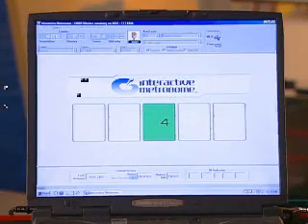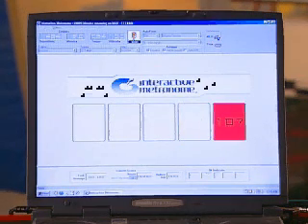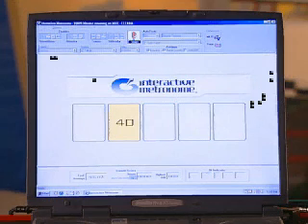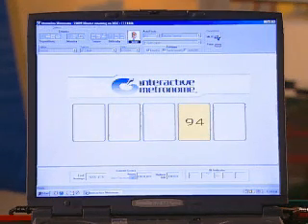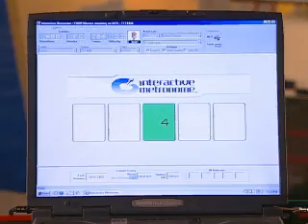If a patient initially has difficulty working with the audio feedback, the IM system also incorporates visual feedback that the therapist can temporarily activate. The visual component reinforces the audio feedback when the patient hits early or very early before the IM beat, or late or very late after the IM beat. The patient hears a reward tone and gets the green light when they are matching the beat very closely.